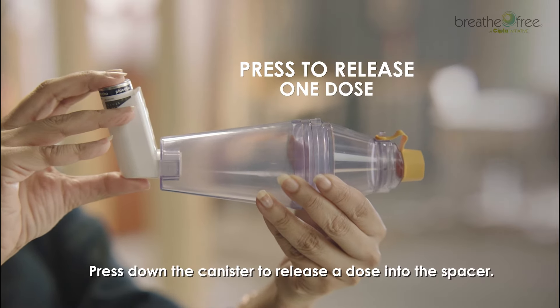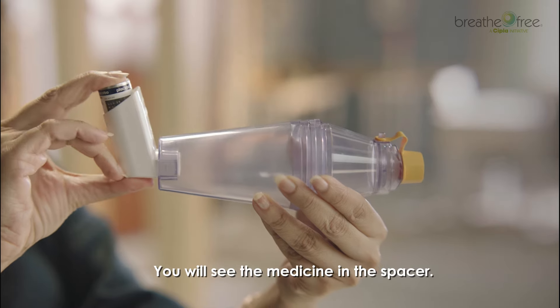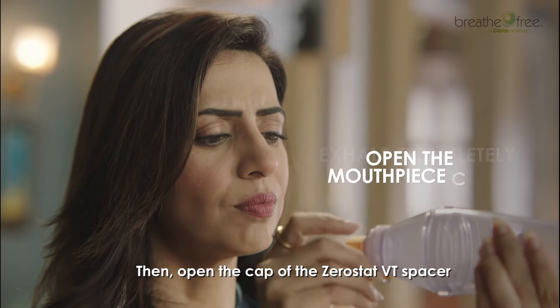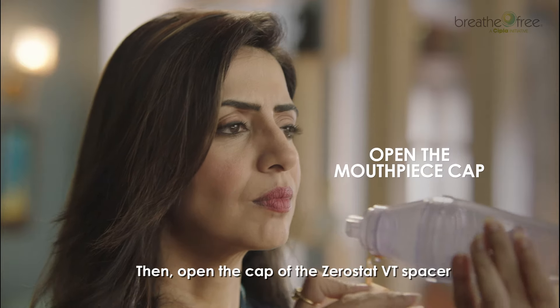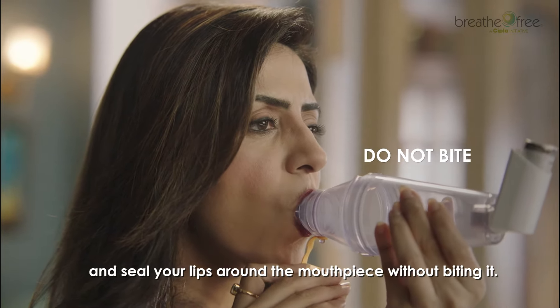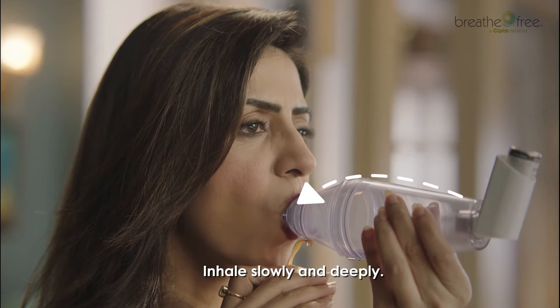Hi, we are going to learn how to use a Zerostat VT spacer with pressurized meter dose inhaler in simple steps. The Zerostat VT spacer has parts like inhalation chamber, a lock, a mouthpiece cap, a mouthpiece, and a slot to put in the inhaler.